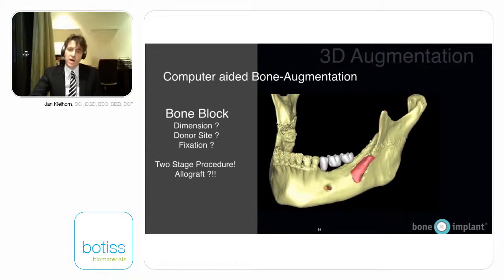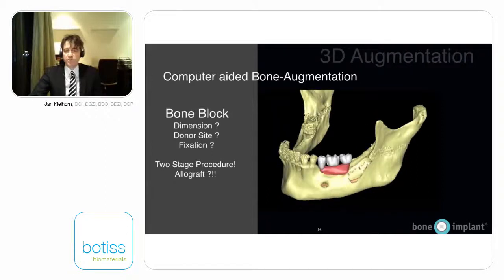So the software allows you to measure the bone block, to measure the linea obliqua externa. You can really design how deep you have to cut, and you can again use a piezo surgery to cut onto the point to be very safe not to harm any anatomic structures. So this is really superior to any microsaw or to any burr you might use. That's why I like to use the piezo surgery for all kind of cuts in bone.